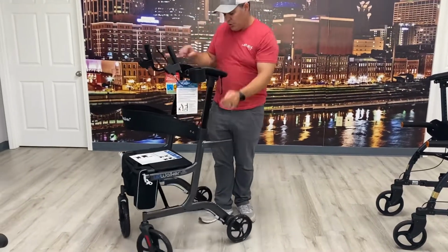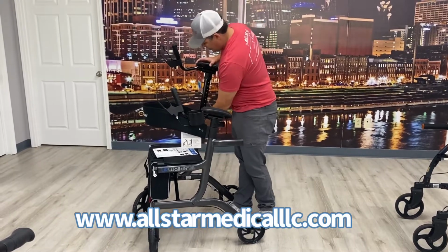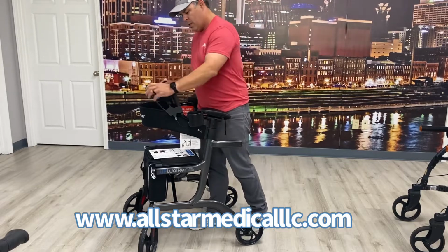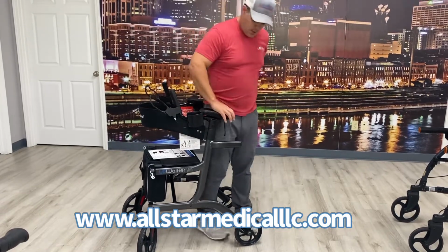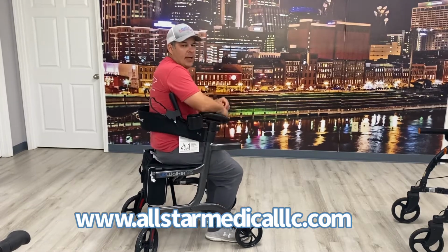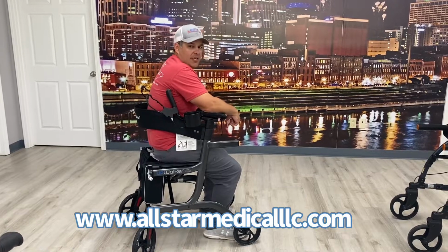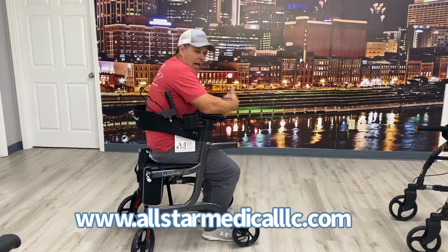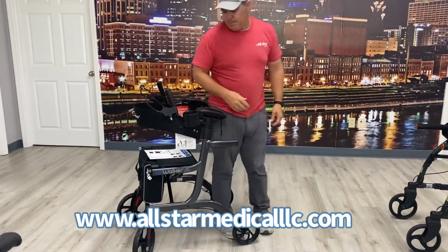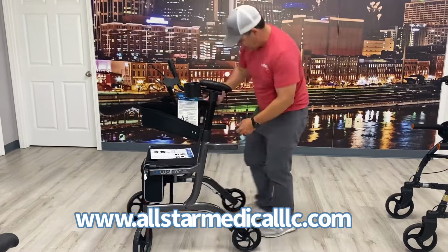So when you want to sit, what I like to do is push this all the way down. Then I make sure my wheels are locked. Then I can either go here or here, and I can sit down. And I can actually rest my arms like this. That is a nice feature that you get from having this adjustment here. You go to stand up, push up, come back here. It's just a click of a button. I want to make sure you see that right there.